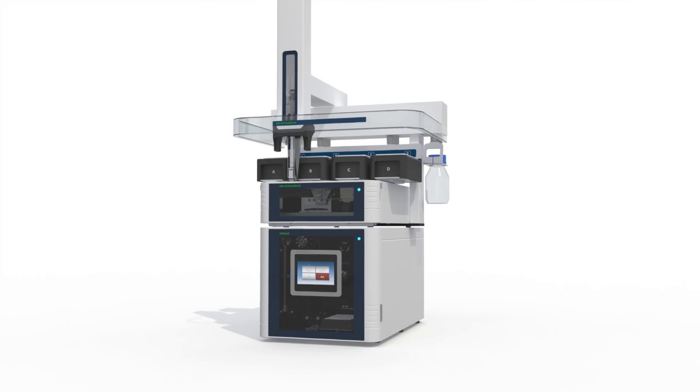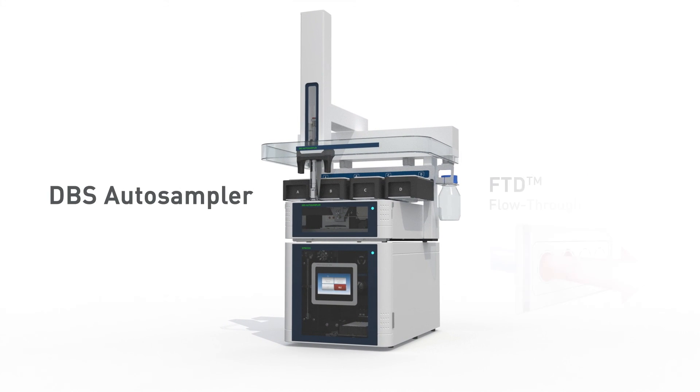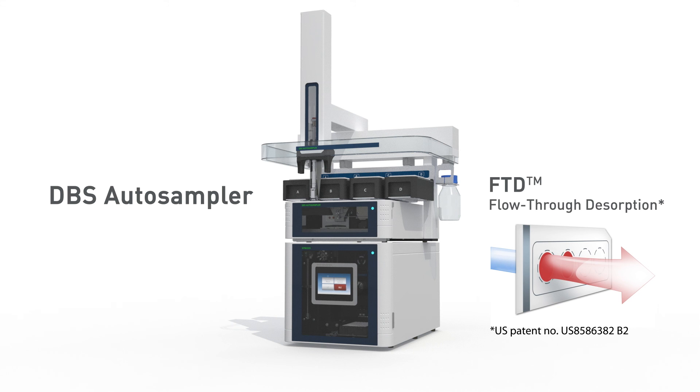Complete automation of dried bloodspot analysis is now possible with flow-through desorption technology from Spark Holland.